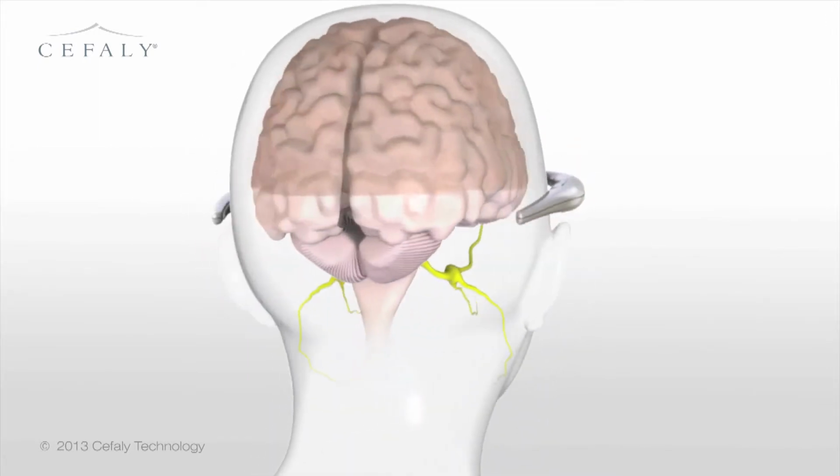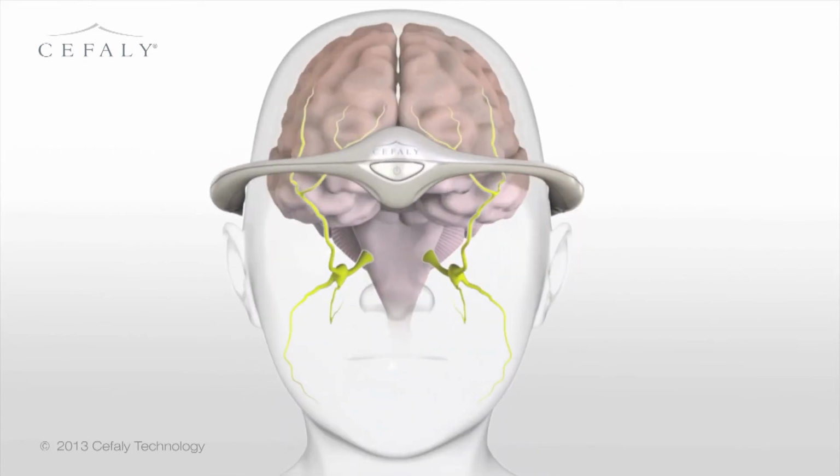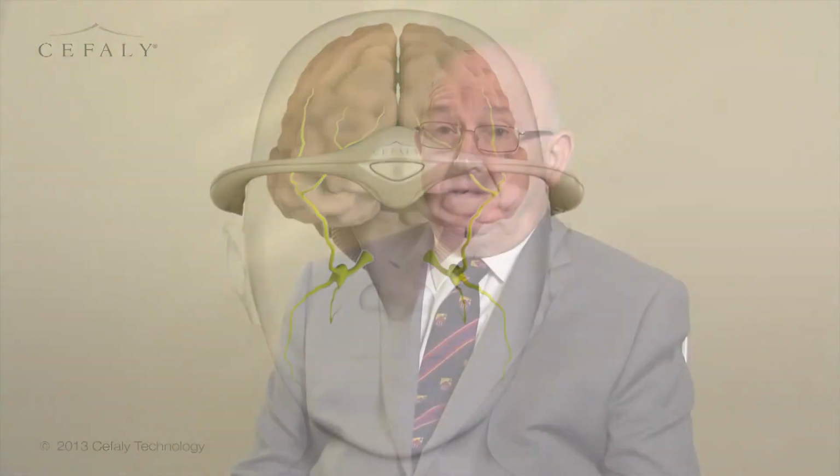And the impulses from the Cefaly electrode are then transmitted through the branches of the trigeminal nerve and produce an area of numbness, change sensation, all the way up to the crown of the head. So that this sensation is associated also with depletion of the various neurotransmitters that are said to be associated with the production of migraine, muscle contraction headache, and in some cases cluster headaches as well.